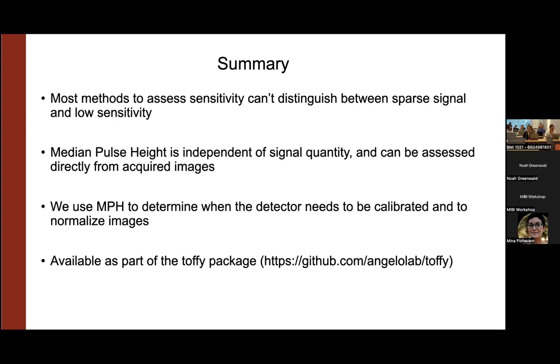So, we still recommend maintaining that 80 to 120% range. But this would be a post-processing way to correct for the deviations outside of that in the detector gain. So, yes.